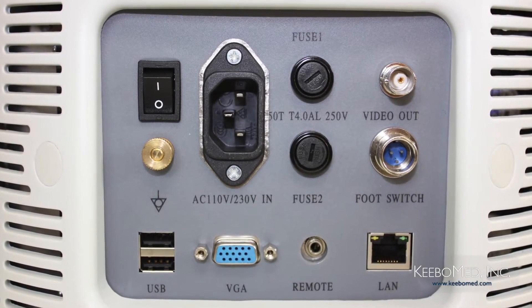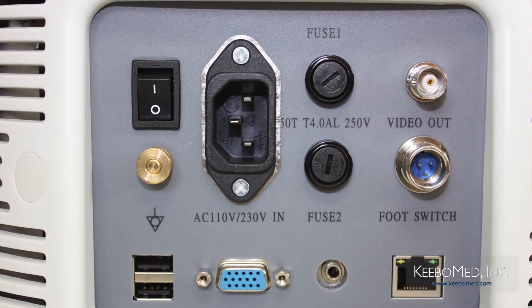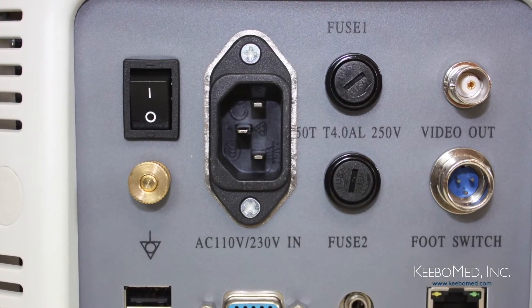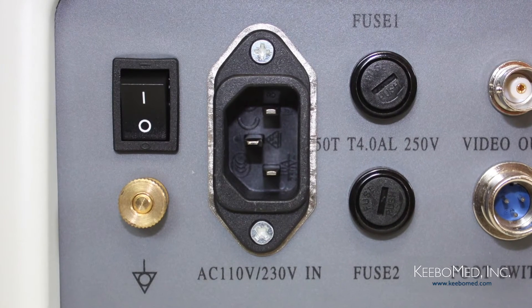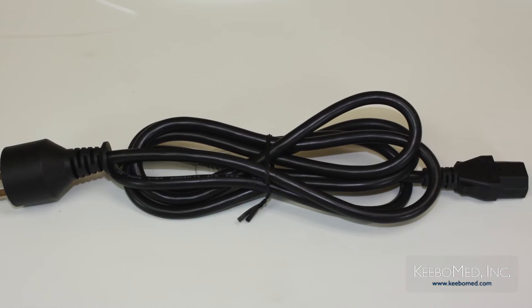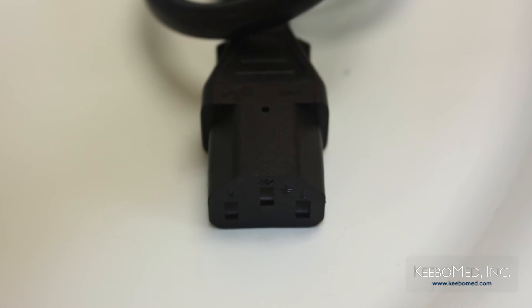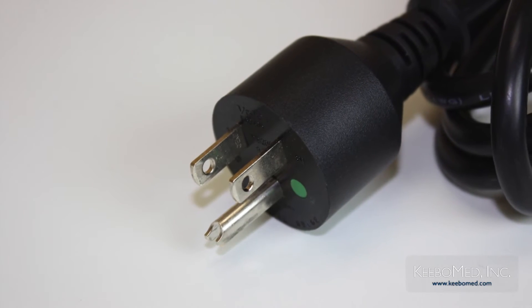It is important to make sure that the AC voltage matches the power requirements indicated on the system's label. Connecting the system to the wrong power supply may cause damage to the system and danger to the operators and patients. It is important to use the power cable that is provided to ensure proper function. The power cable provided is a 3-wire cable and uses a 3-pin grounded plug, which has a grounding terminal.